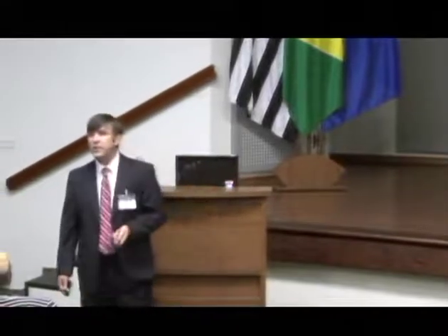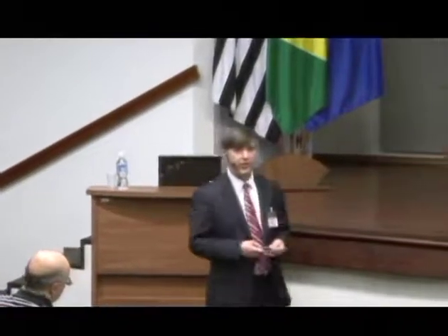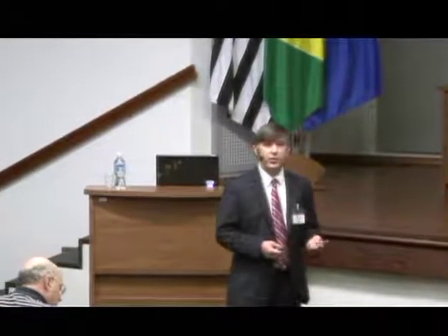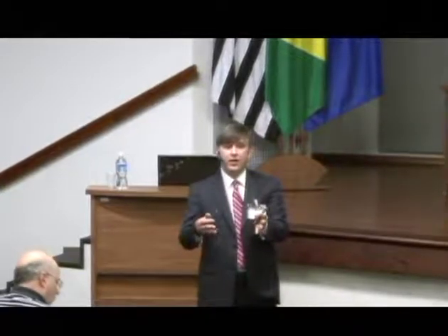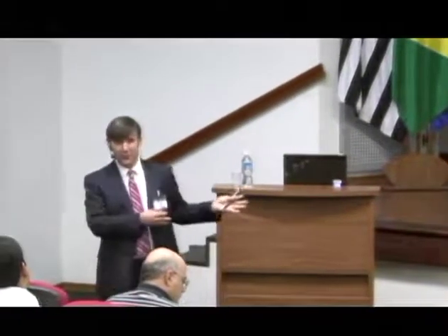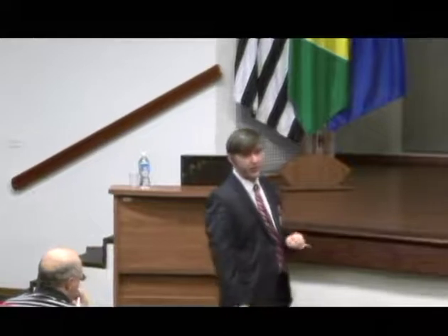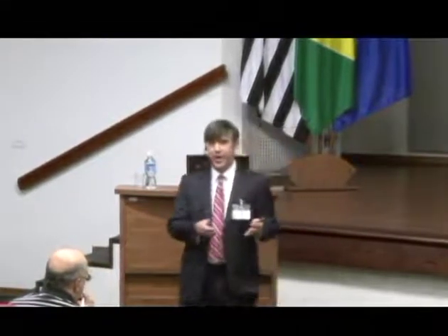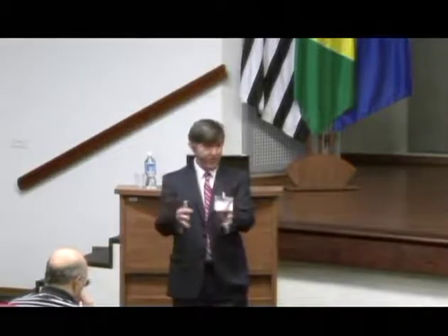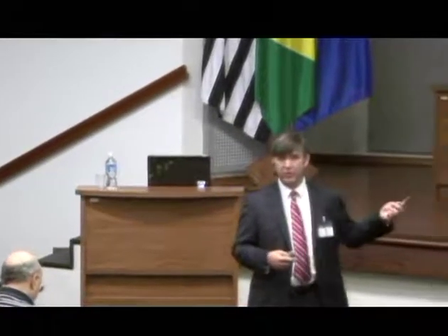And finally, these instruments need to be fast. As I said, these are diagnostic instruments that are in support of the clinician's evaluation of the tissue. And so it's important for us to be able to get into the operating room, set up, do our measurements, get the information to the clinician that the clinician needs, and then get out of the way as fast as possible so that whatever needs to happen can happen. We've gotten better and better at this over time to the point where now we can usually get the time from when we enter the room, set up all of our equipment, do the measurements, and get out of the room down to about 5 or 6 minutes for doing 3 different modalities. So we're getting better at that than we used to be.